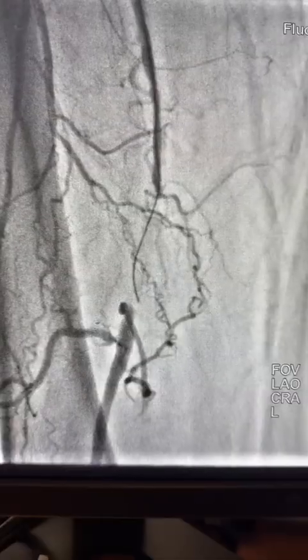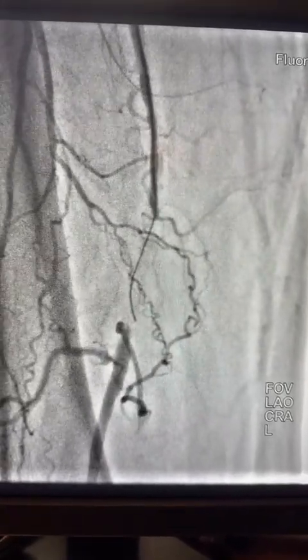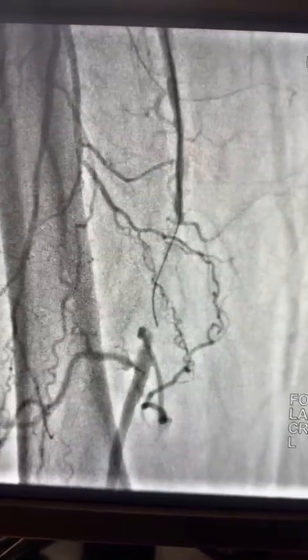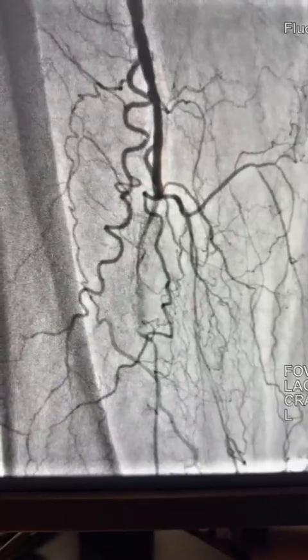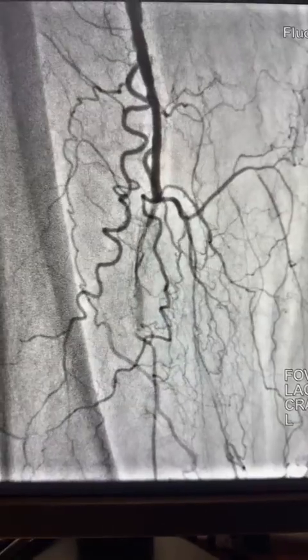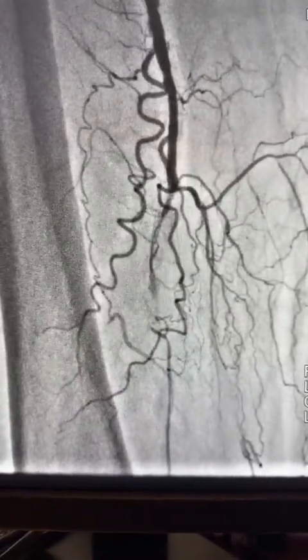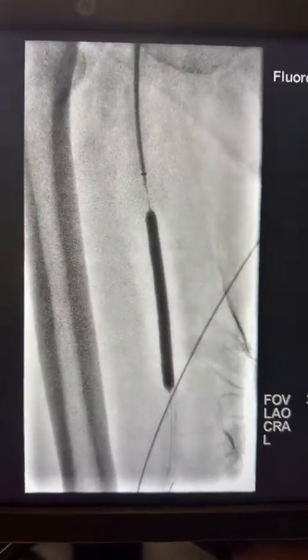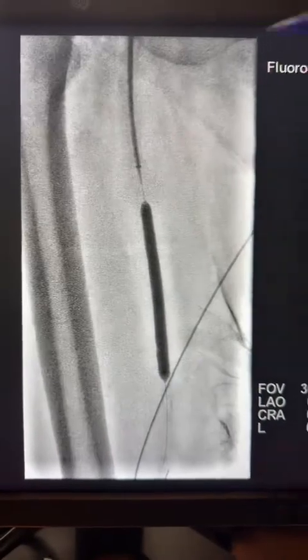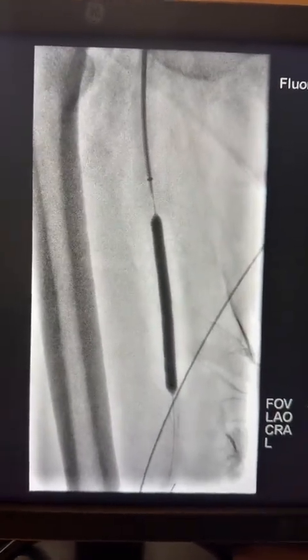I exchanged the wire to a stiff glide wire supported by a glide catheter, which also did not pass through the CTO cap. Here is the injection through the glide catheter positioned distally. I then proceeded with angioplasty of the proximal-to-mid segment to allow advancing the catheter without damping pressure.